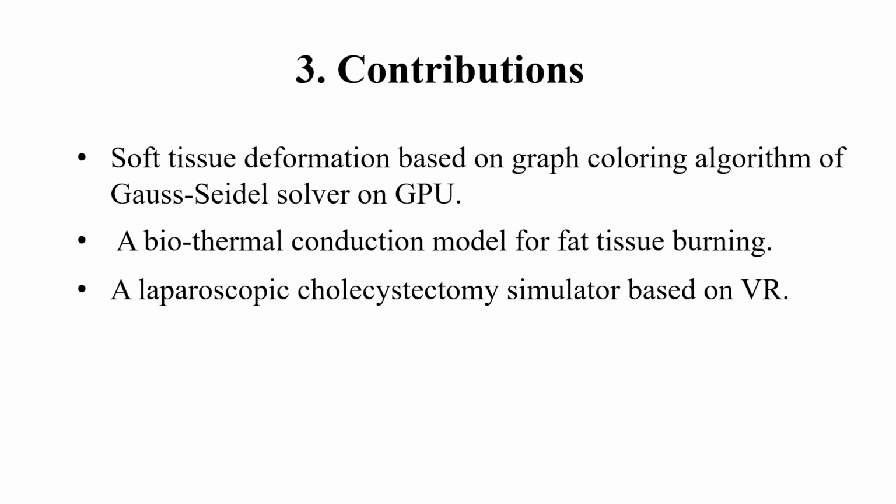The contributions consist of a deformation model of soft tissue based on graph coloring parallel acceleration, within the position-based dynamics, PBD, framework, a biothermal conduction model for fat tissue burning, and a hybrid multi-model connection method, which can simulate the separation of the gallbladder from liver in real time.